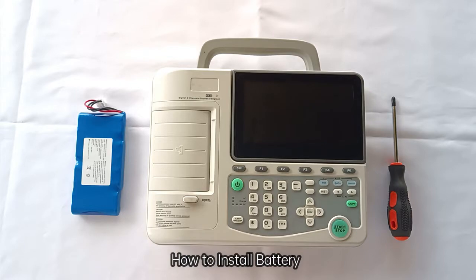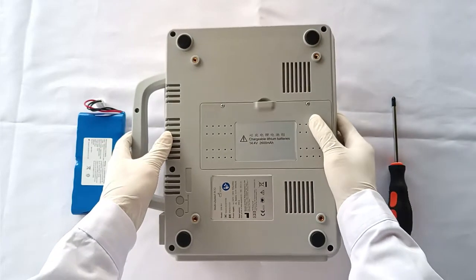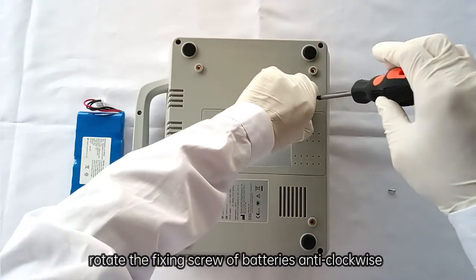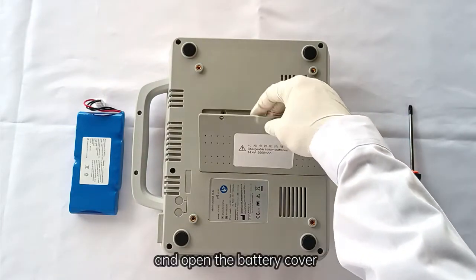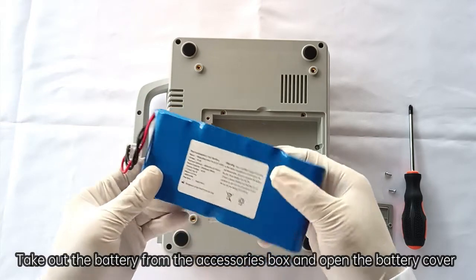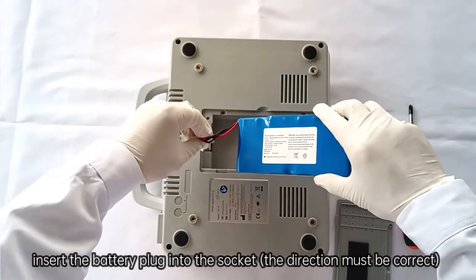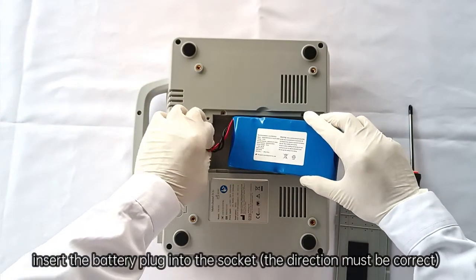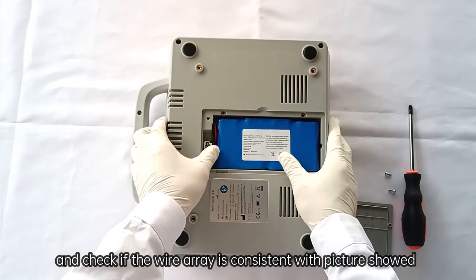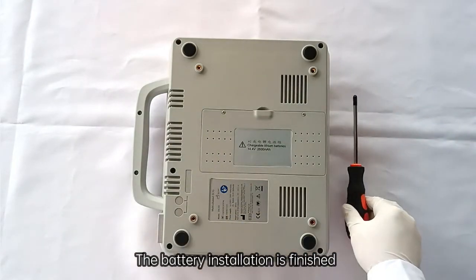To install the battery, turn the ECG machine upside down. Rotate the fixing screw of the battery compartment anti-clockwise and open the battery cover. Take out the battery from the accessories box, and insert the battery plug into the socket — the direction must be correct. Check that the wire arrangement is consistent with the picture shown. Close the battery cover and screw it clockwise. Battery installation is finished.